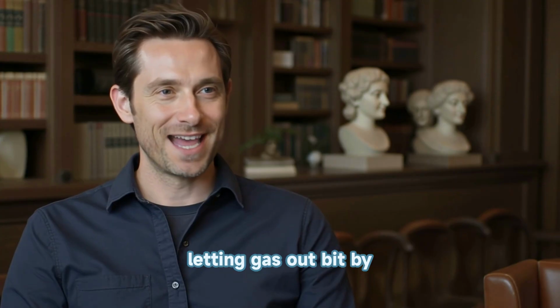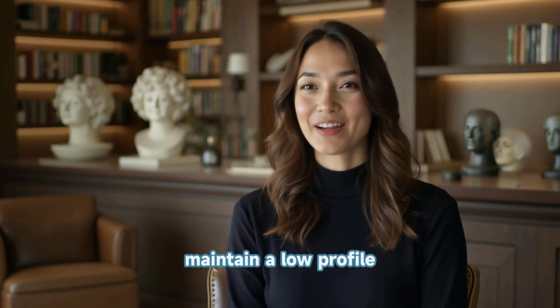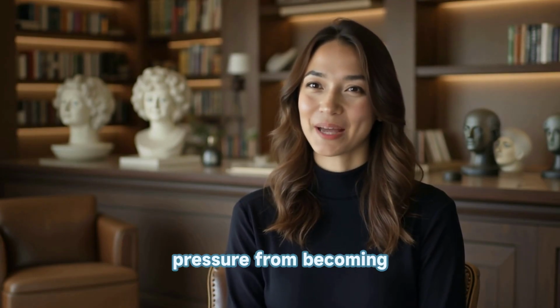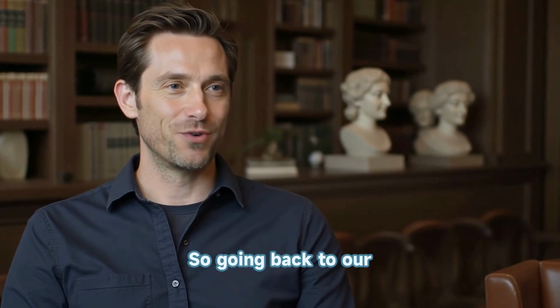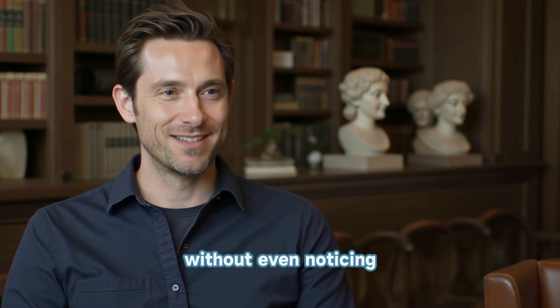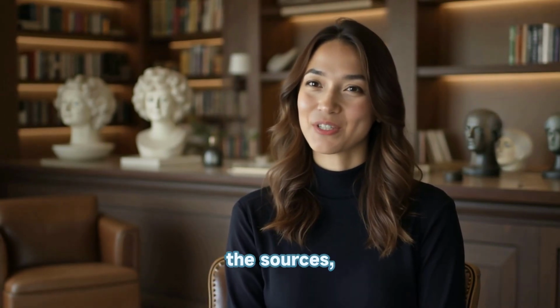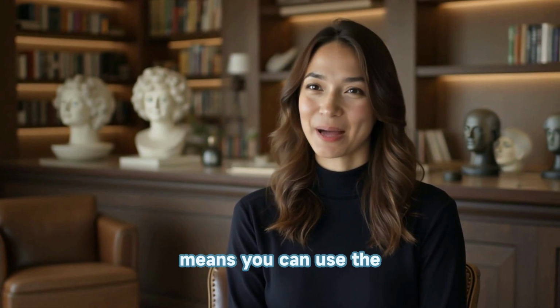So the filter is basically this quiet little worker, just letting gas out bit by bit to keep the bag flat. That's the idea, working behind the scenes to maintain a low profile and stop that internal pressure from becoming an issue. Okay, so going back to our listener, they used the bag for 3 years without even noticing the filter. The bag was still doing its main job collecting output, wasn't it? Oh, absolutely. The filter doesn't affect the basic collection function. That works regardless. And this is really the key takeaway from the sources: understanding the filter means you can use the bag more effectively.